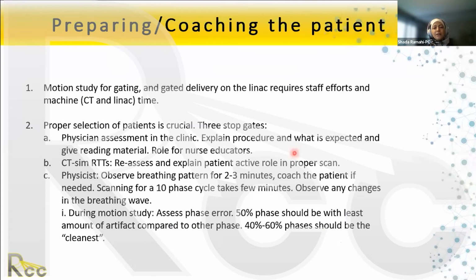Usually the initial coaching is done by the physician, or if your department has a nurse coordinator. I've worked in a department where they have nurse coordinators, nurse educators. So the nurse educator would spend time with different patients according to what they're going to go for treatment. And part of their work is educating the patients who will have motion management done on them. So this is the first coaching or training. Usually it's a week before or 2 weeks before CT SIM, depending on when the patient comes in for the clinic. And then on the CT simulation appointment, they have a good 1 hour scheduled.